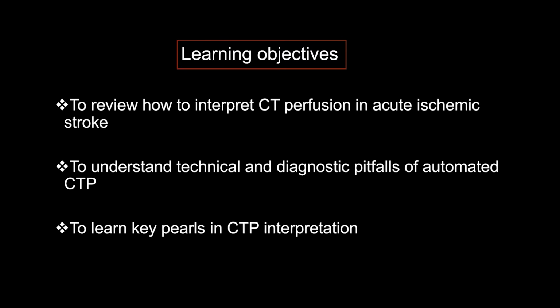Most of you are already comfortable with the CT perfusion as we have started using them in these past few years in the treatment-making decisions for our acute ischemic stroke patients. But let's get into these learning objectives and learn from some of the cases that I have for you today.